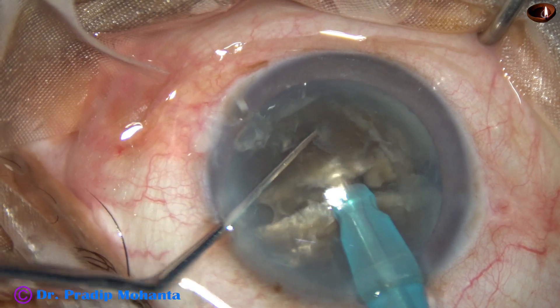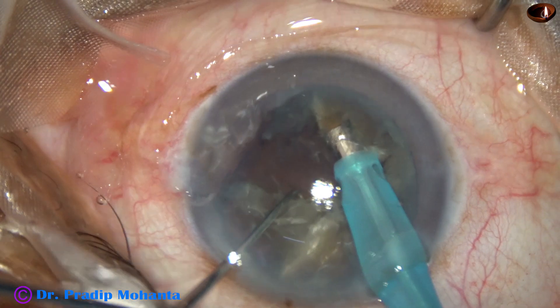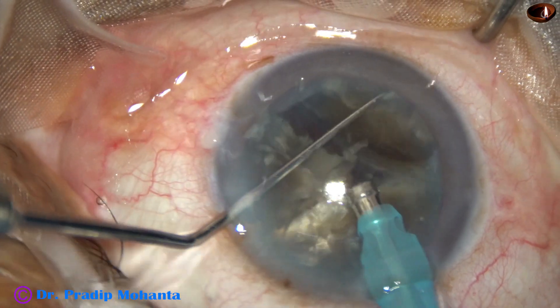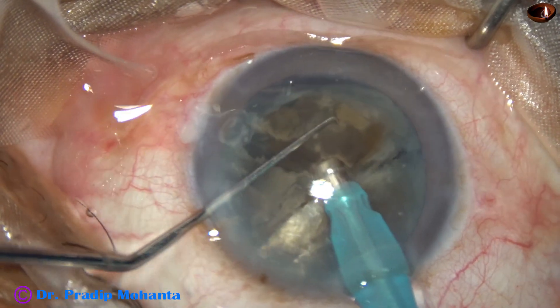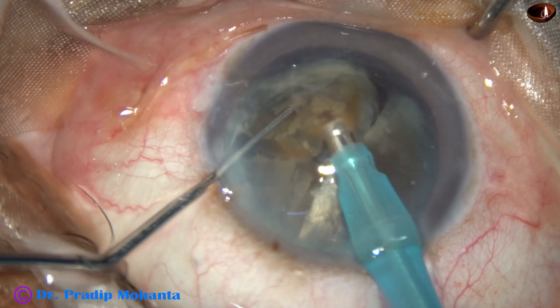Now one hemi-nucleus is again being chopped by the same way — the submarine chop technique. One piece is tilted and emulsification is started from its apex.